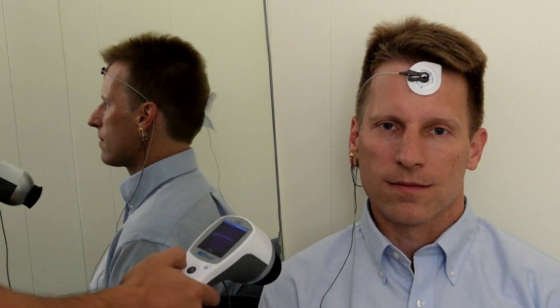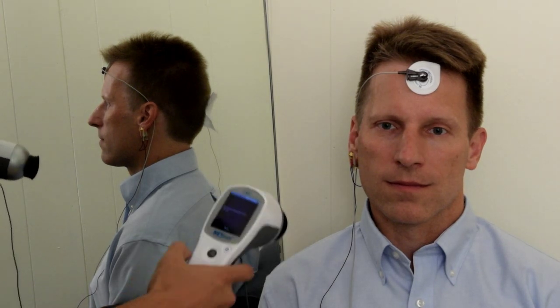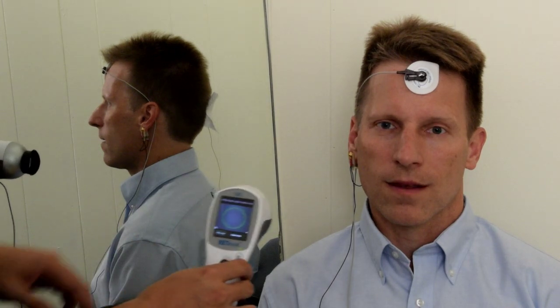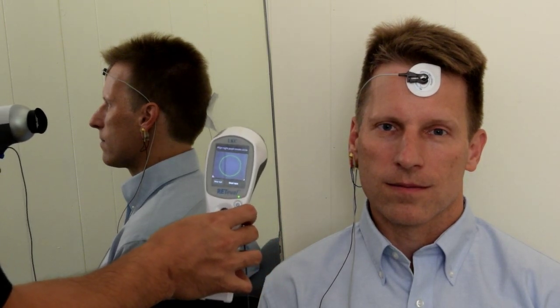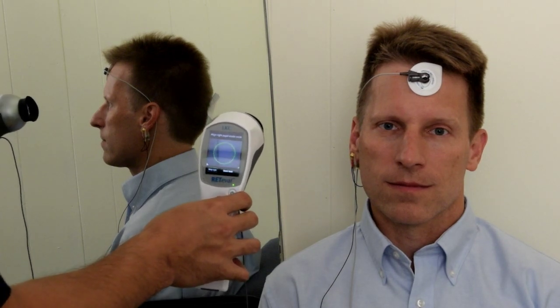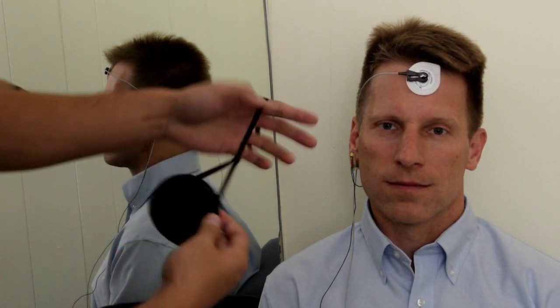Once you have all three connected and there's a good connection, you can move forward with the test. Notice that the device starts testing with the patient's right eye. You will be testing the device with one eye at a time. While testing, inform the patient to keep both eyes open and you want to patch the contralateral eye.